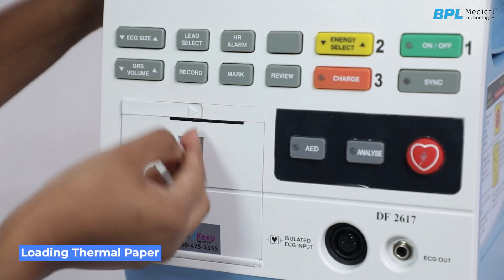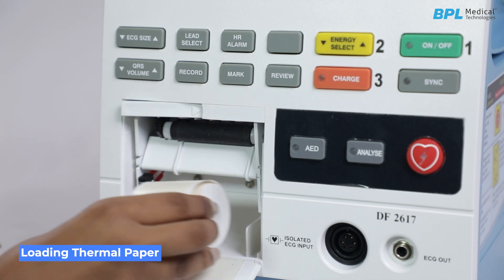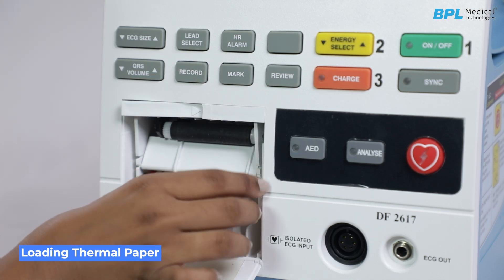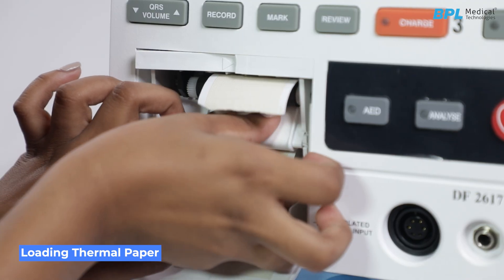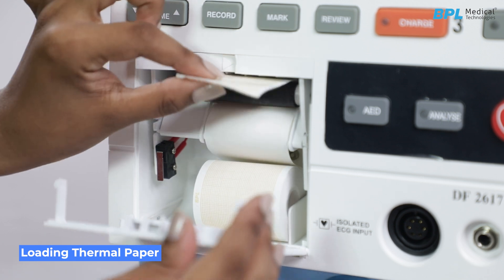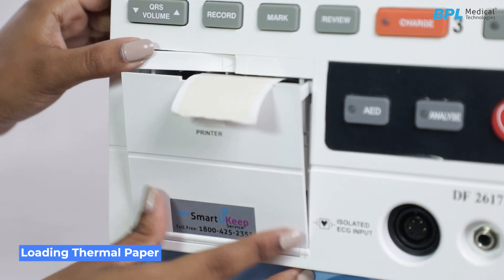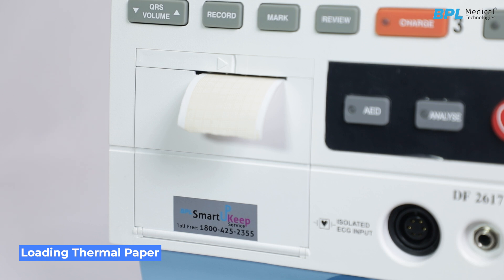Loading thermal paper: Push the lever fully by pressing on the mark to open the door. Insert the paper below the roller with the grid facing down. Make sure the paper extends about 25mm above the roller. Align the paper with the provided guides. Push the lever back on the left-hand side to prepare for operation, then close the printer door securely.